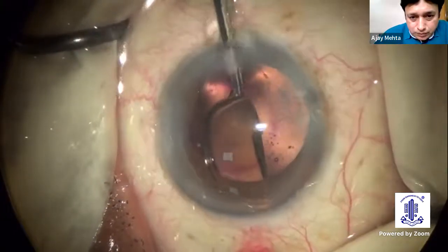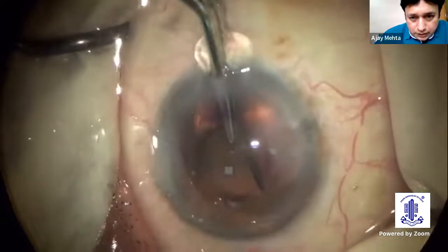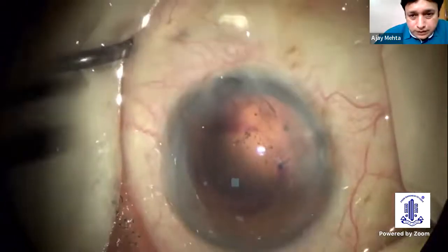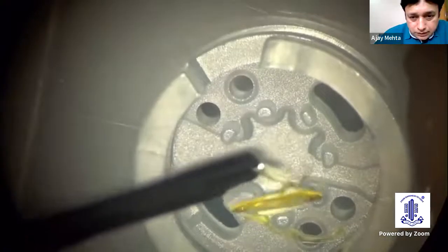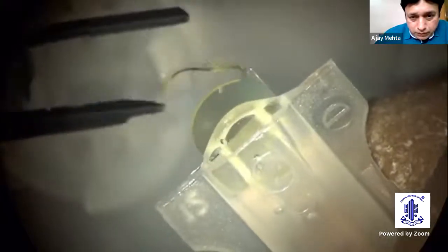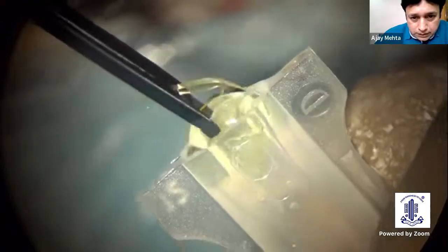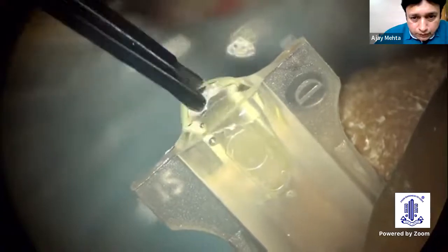The second piece, I could support and take out with the help of a good dispersive viscoelastic. Now I thought that instead of a preloaded injection of IOL, let me load a lens myself under good supervision and a good microscope, taking all the necessary steps into consideration and putting the loops over one another.